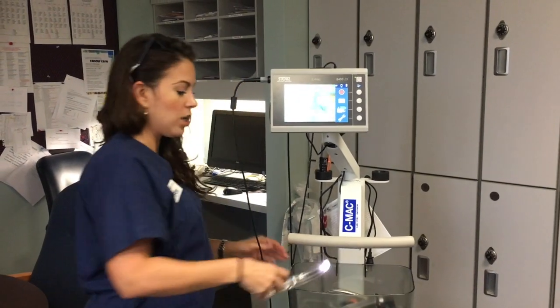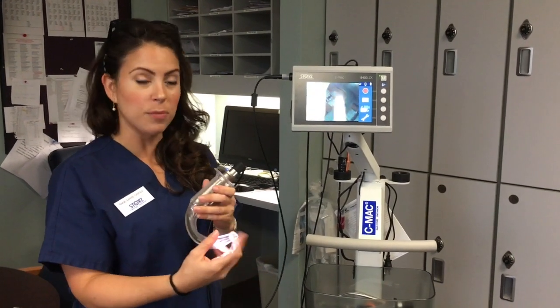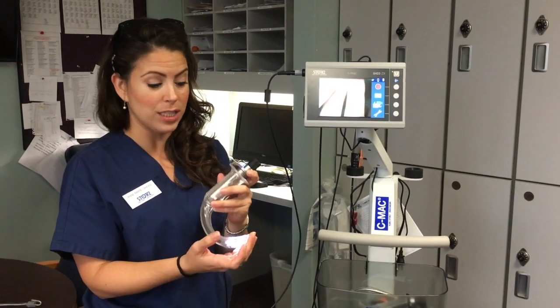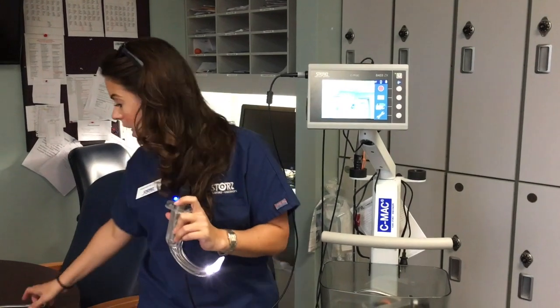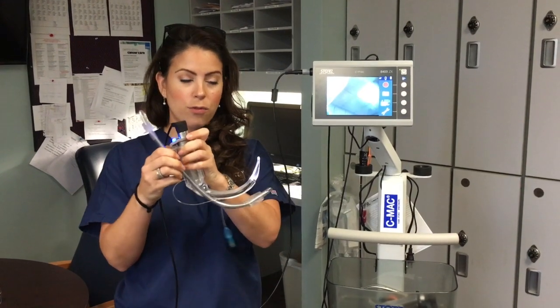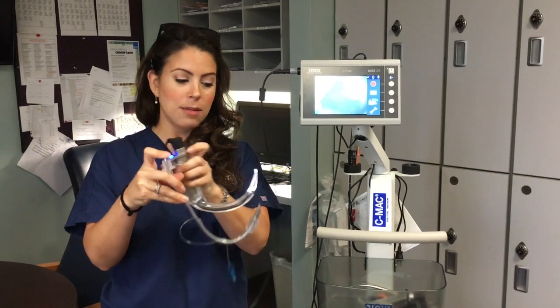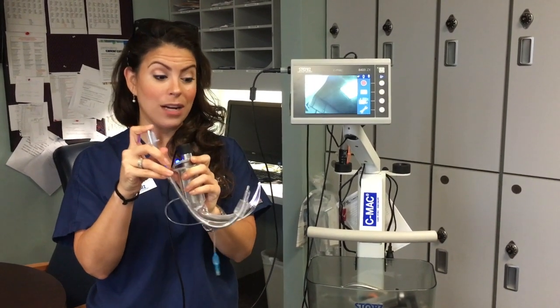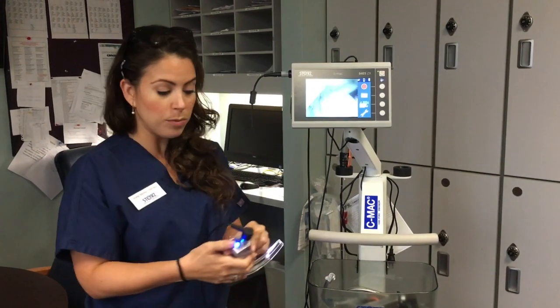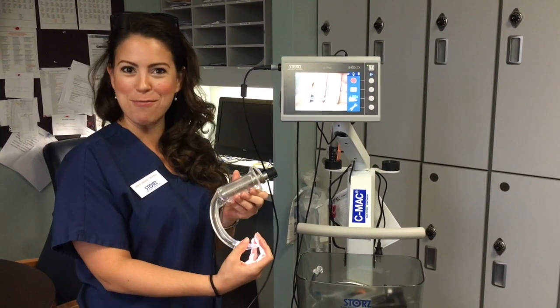For your adult video laryngoscope, you'll be looking at your monitor and will always see the tip of the blade on screen — that's our safety feature to prevent soft palate perforations. This is the D blade. You can use a regular disposable stylet, but instead of a 25-degree angle for a MAC 3 or 4, I recommend hyper-angulating the stylet to match the curve of the blade so that with anterior airways you can get the tube through the cords at that acute angle.